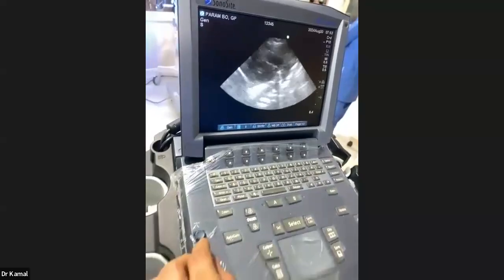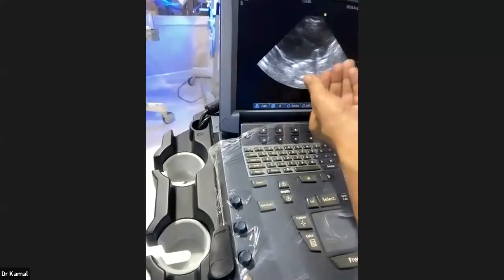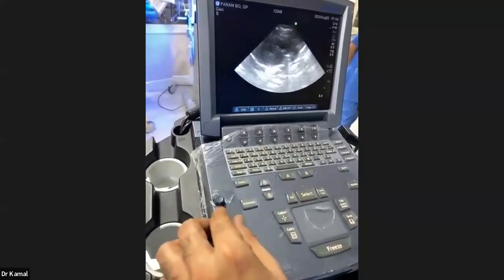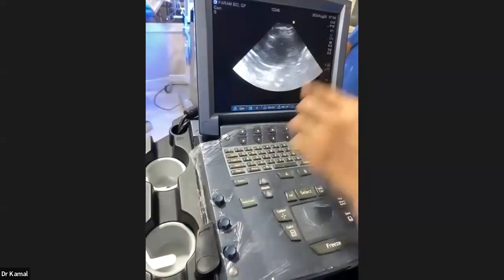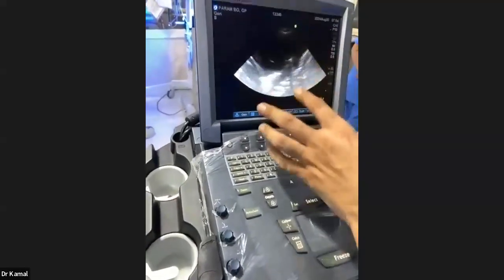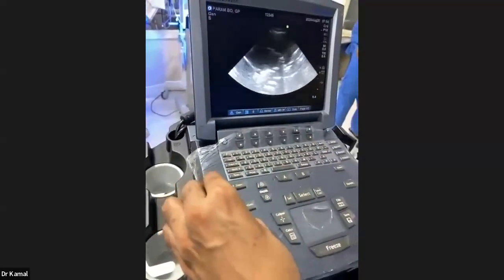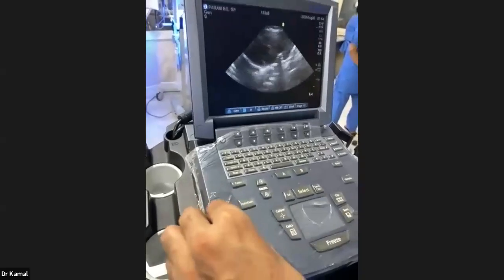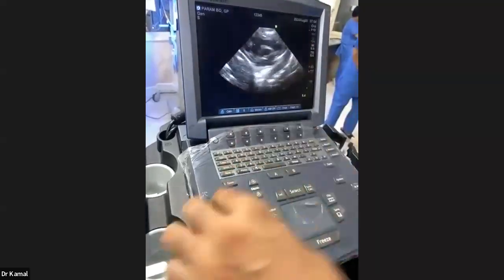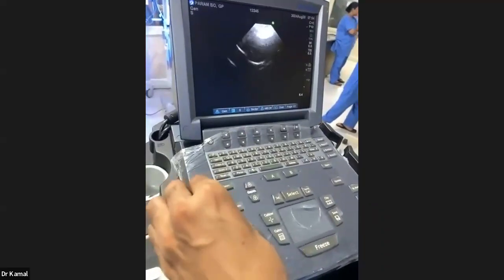So I increase it, so this machine divides the image into half, not into 8 parts, but into half. So more signals are coming from here rather than from this part. You can see, I've increased this. So the lower part is getting enhanced, and the upper part, if I decrease the signal from there, is getting black. So the signal is down at this point and higher from this point. But if I'm interested in the upper part and not the lower part, now I'm getting less signal from here as compared to this place. Now you see, this is getting black and this is getting enhanced.